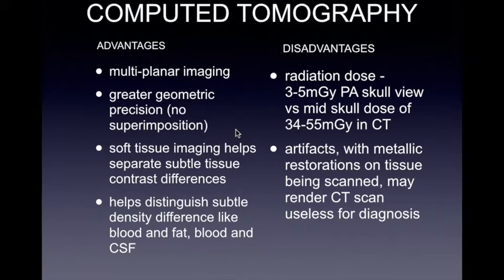Definitely, the greatest advantage is creating a three-dimensional image, a multiplanar image of your patients. This is a far outcry from the old two-dimensional plain film X-rays that we have, or radiographs, sorry. Because of that, we have greater geometric precision. We could see what is underneath, what is behind, what is above, below, medial, lateral of something. It now gives us the ability to look into our patient like never before.